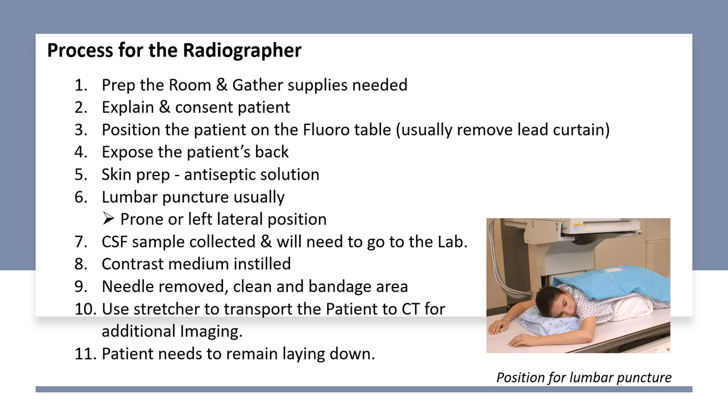Lumbar puncture is usually the most common. So obviously they will be prone or in the left lateral position. Cerebrospinal fluid samples are collected after they numb the area and insert the needle. Then they would take some cerebrospinal fluid off and usually collect it and send it away for testing. You will need to go to the lab, so you have your lab form. Contrast medium is instilled. The needle is removed, the area is cleaned, and a bandage is placed on.